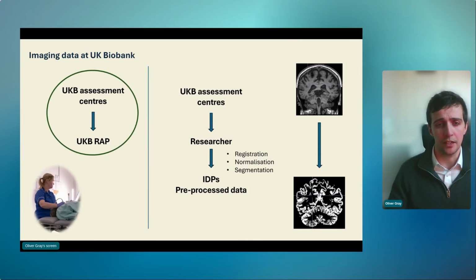So the data collected from clinics gets sent to researchers and transformed into imaging-derived phenotypes, numeric summarizations of the structure, function, and any relevant features that are in those images. For example, total grey matter volume of the brain. And then pre-processed images are made ready for further downstream analysis, and we provide those in machine learning ready formats, and we're continually improving and taking feedback on board about that data and how to improve it.